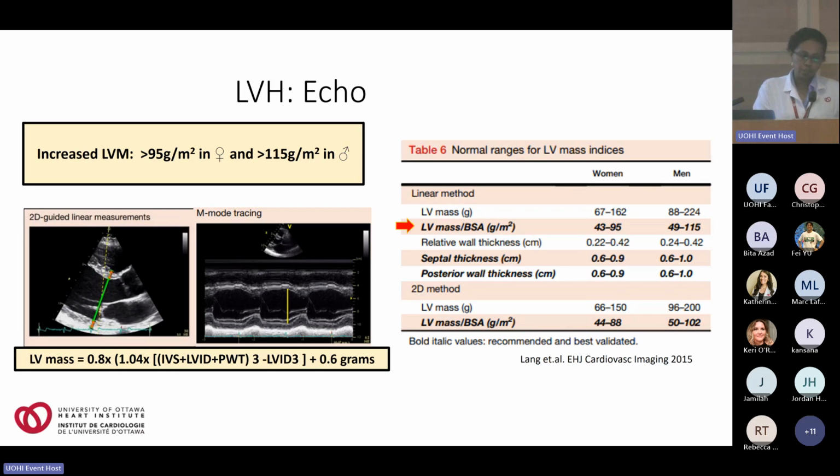So it's commonly encountered in imaging labs, and although we sometimes hear wall thickness being used to define LV hypertrophy, the proper diagnosis is actually based on the evidence of increased LV mass. The increase in LV mass can occur due to wall thickening, or it could be chamber enlargement. I'll discuss this with the coming slides.